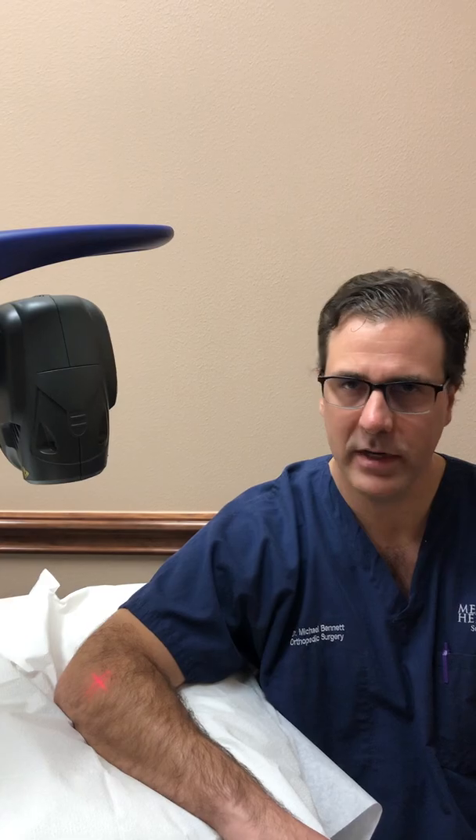We're utilizing this in chronic tendonitis, acute tendonitis, sprains, strains, rotator cuff injuries, knee pain, and arthritic pain.